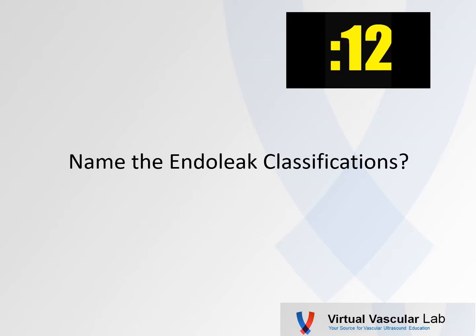So if you work in a vascular laboratory, this is not an uncommon examination. This is because people undergoing endovascular repair of an abdominal aortic aneurysm generally require follow-up for life due to the possibility of developing an endoleak, that is, active blood flow outside the graft in the residual aneurysm sac. So if you're doing this examination, you should be familiar with the classification of endoleaks. There are 5 of them. Do you know them?